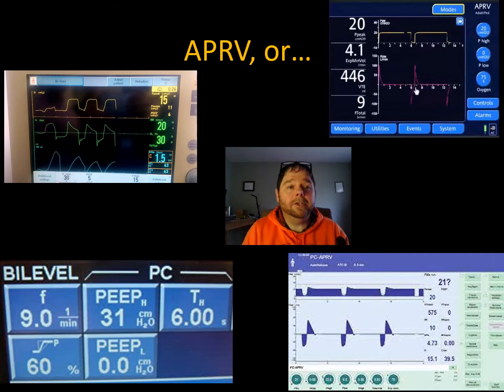So that moves us into what I wanted to talk about in terms of our ventilator and what our ventilator can and can't do, and the patients that we're seeing more continuously out in the region and in our own facility who are being ventilated with APRV. APRV stands for airway pressure release ventilation, and depending on the ventilator you're going to see, it'll be called either APRV or PC-APRV or something else.